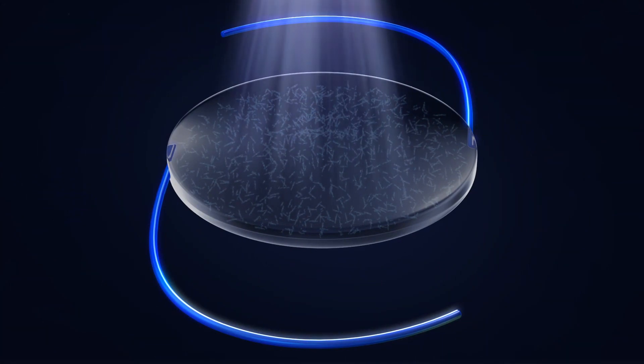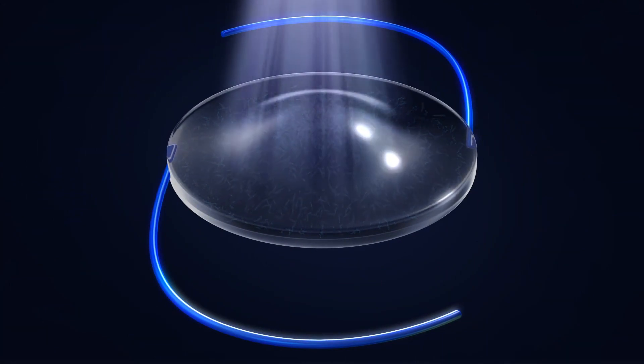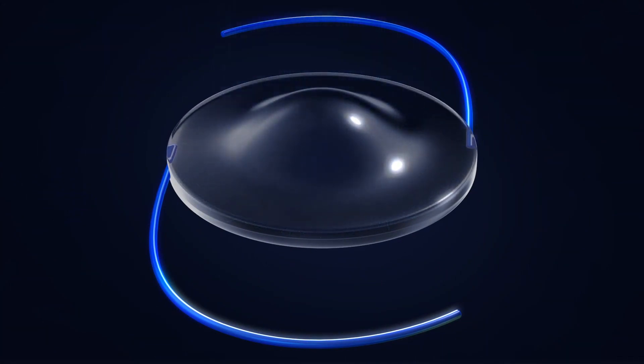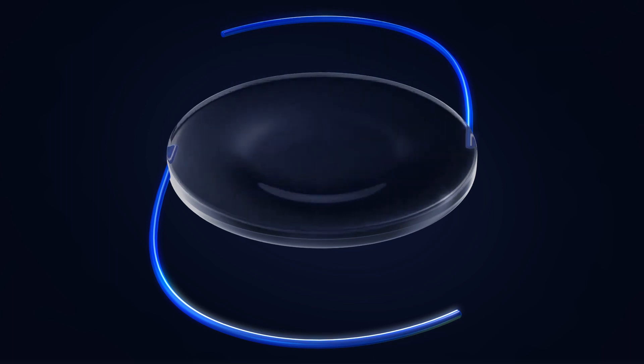The remaining unreacted macromers physically diffuse into the exposed area, causing a highly predictable change in the shape of the lens and a refractive power change of the RxLAL.